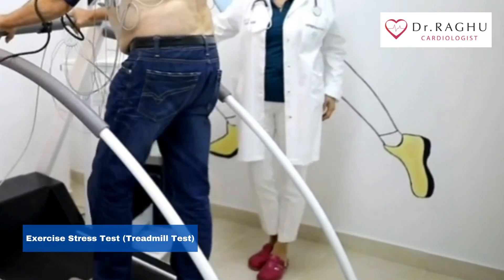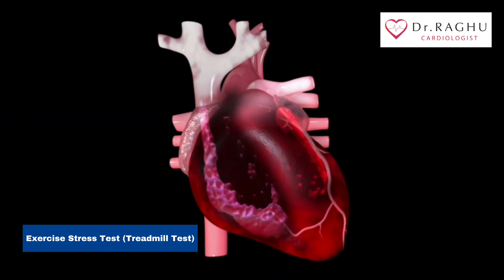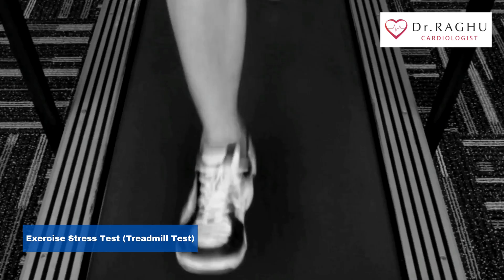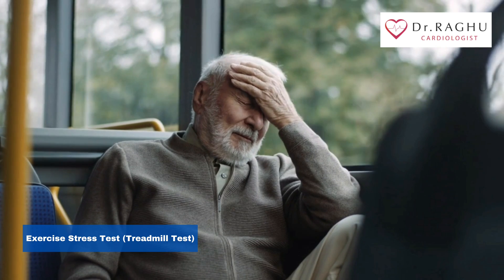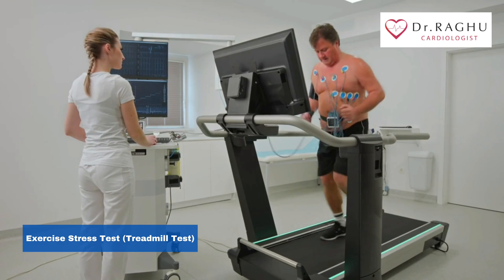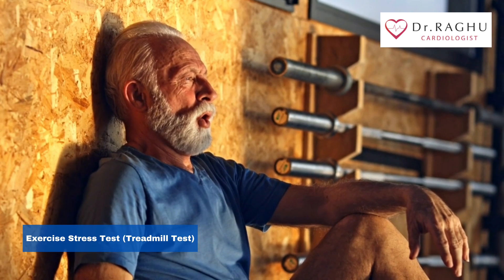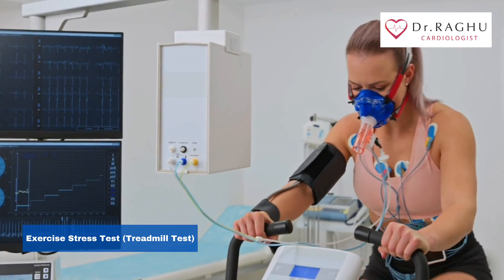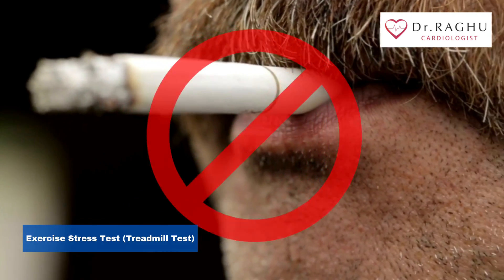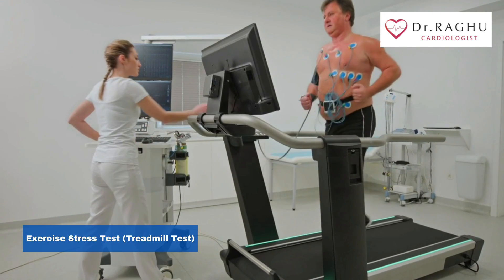An exercise stress test is primarily used to help your doctor determine if your heart receives enough oxygen and proper blood flow when it needs it the most. It can be ordered for people who have been experiencing chest pain or other symptoms of coronary heart disease. An exercise stress test may also be used to help determine your level of health, especially if you're starting a new exercise program. This allows your doctor to learn what level of exercise you can safely handle. If you are a smoker over 40 years old or if you have other risk factors for heart disease, you should talk to your doctor to see if an exercise stress test is a good idea for you.